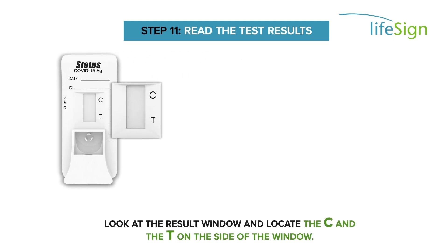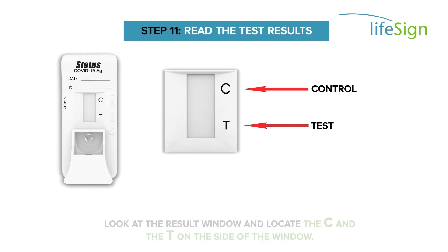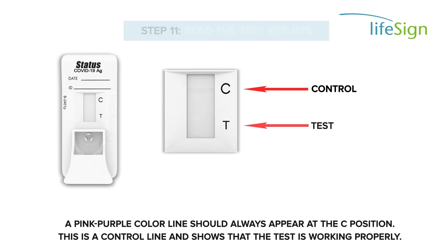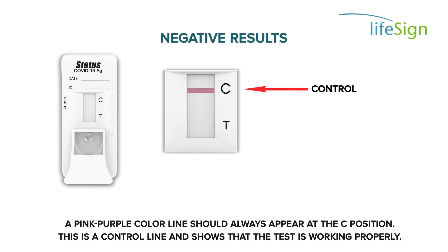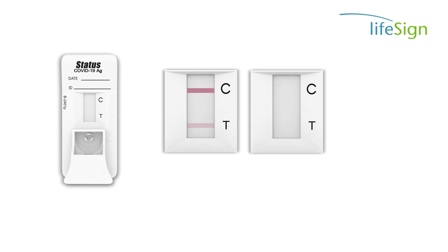Look at the result window and locate the C and T on the side of the window. A pink-purple color line should always appear at the C position. This is a control line and shows that the test is working properly. If a control line is visible and a pink-purple line is not visible at the T position, this means the result is negative.